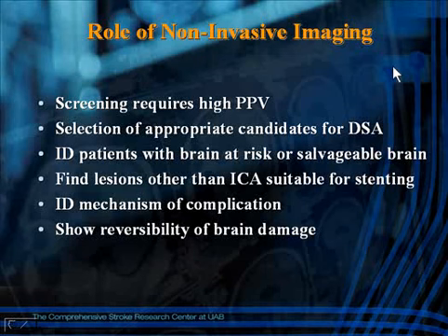The next slide summarizes the role of non-invasive imaging as it applies to stroke patients, and particularly mentions carotid duplex ultrasound here. Screening requires high positive predictive value. It is true that it is better to overcall the degree of stenosis than to miss a significant stenosis or occlusion. The other thing is, however, you need to have locally validated criteria for vascular testing with ultrasound, and that applies to carotid ultrasound as well as TCD as well as other ultrasound practice areas.